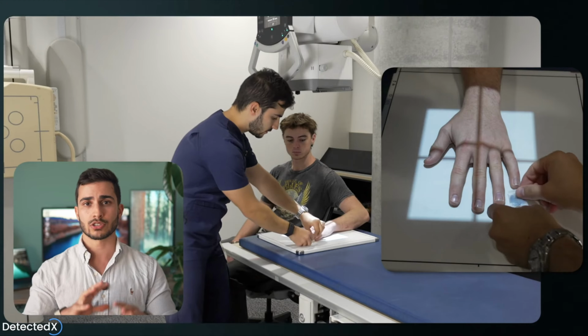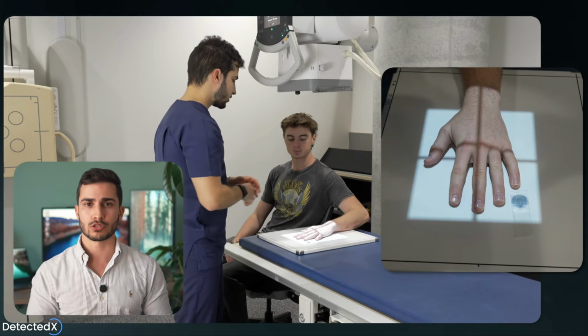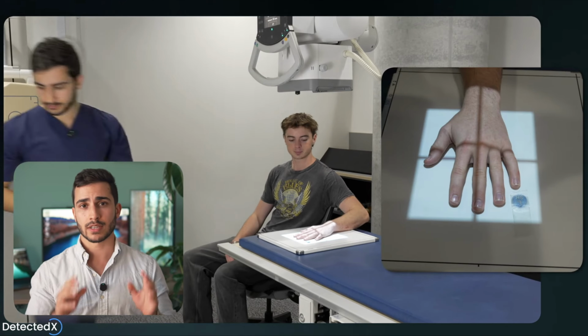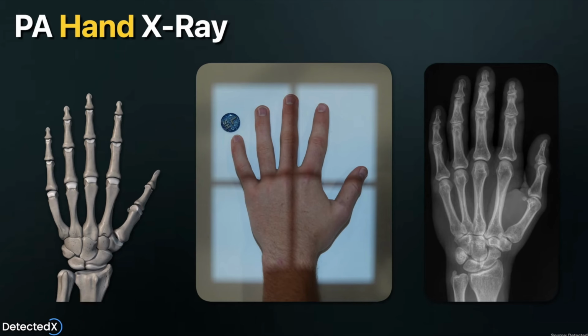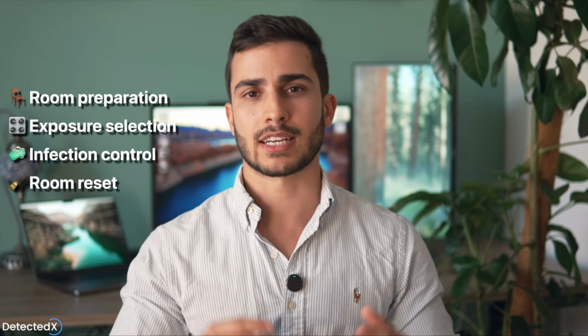Then the fourth module is positioning, where the patient is positioned live for all of the different X-ray projections introduced in the second module, covering how they're done effectively, covering a lot of tips and tricks learned over the years, essentially a comprehensive look at what radiographers do on clinical placement or when they're qualified.